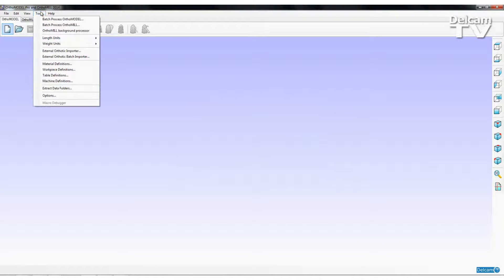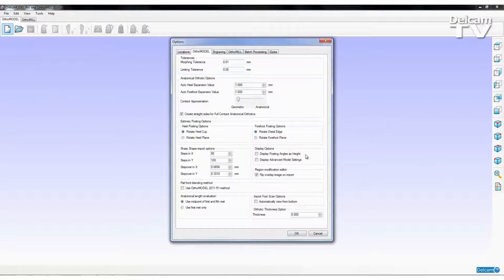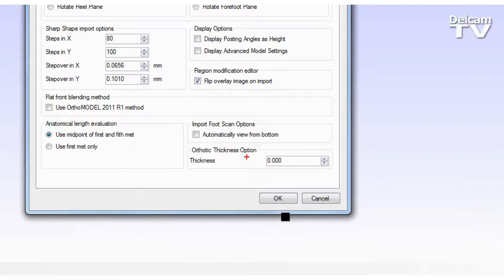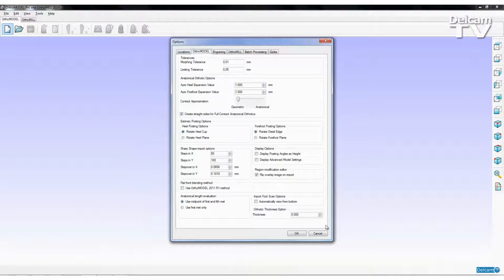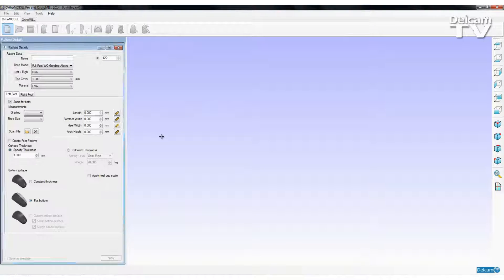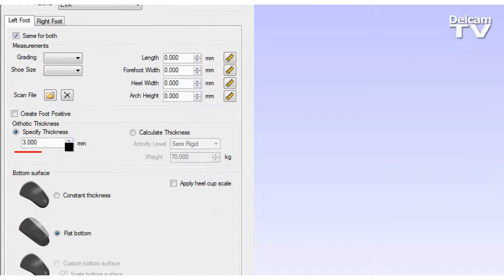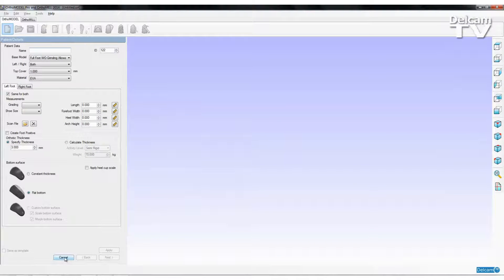The first new feature I'll show you is a couple of additional options that allow us to set up defaults. On the Tools Options page, if I select the AuthorModel tab, in the bottom right hand corner of this tab we've got a couple of new features. The first one is thickness, so this allows us to set the default thickness of an orthotic design. If I change that value from zero to a thickness of three and say OK, then whenever I create a new design and get to the patient details page, the default thickness is already predefined. So that's quite a useful new feature.